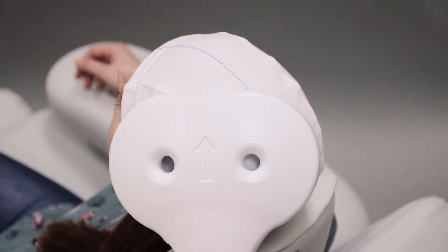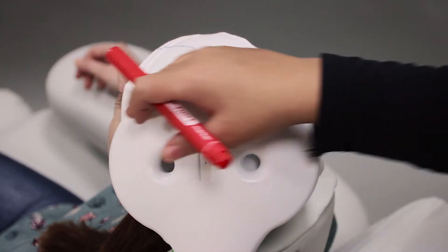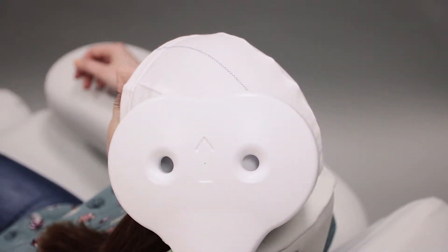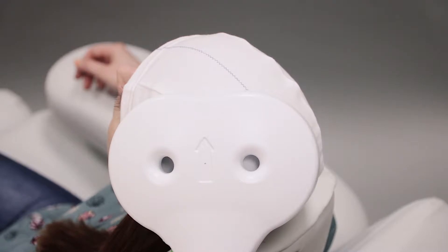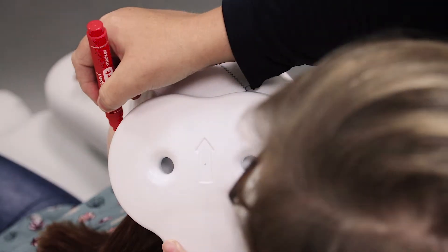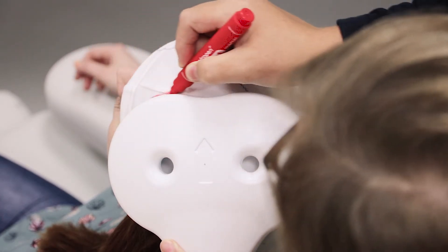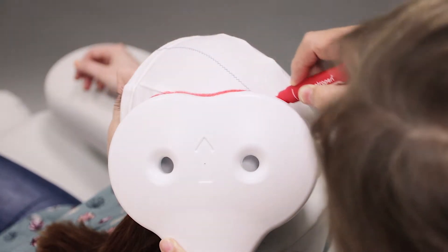The coil is now placed over the hotspot and I have finished determining the motor threshold. I take a marker and draw a line along the front edge of the coil.